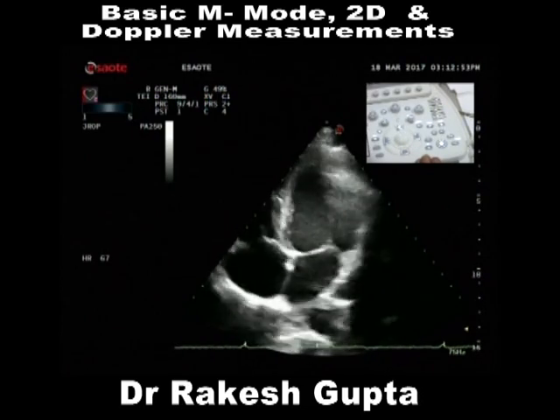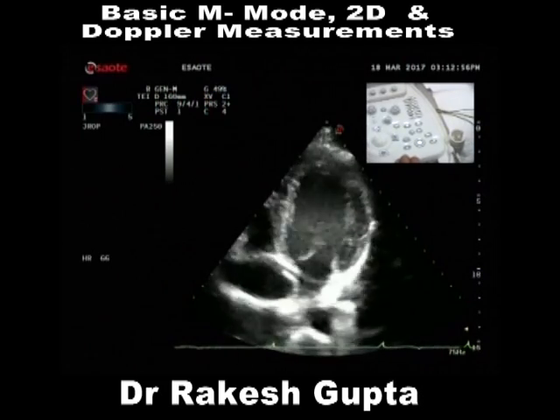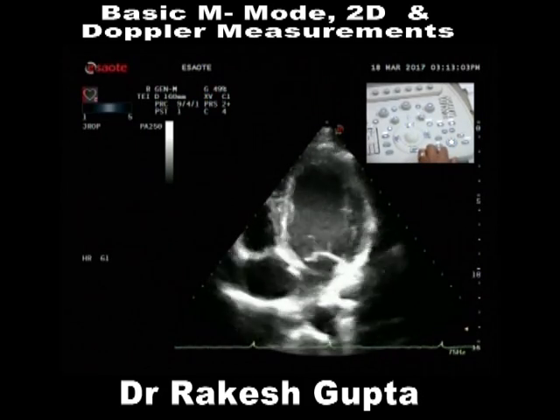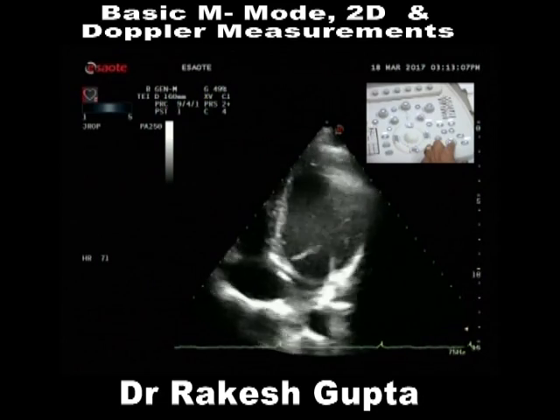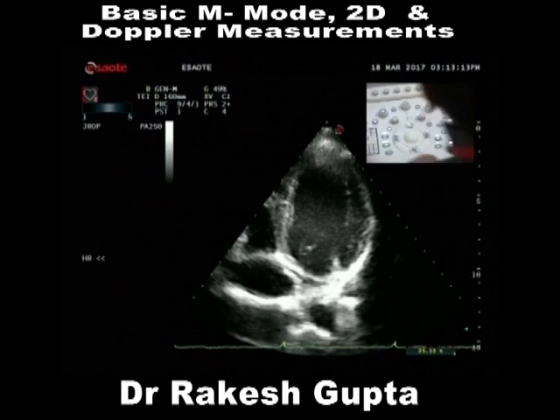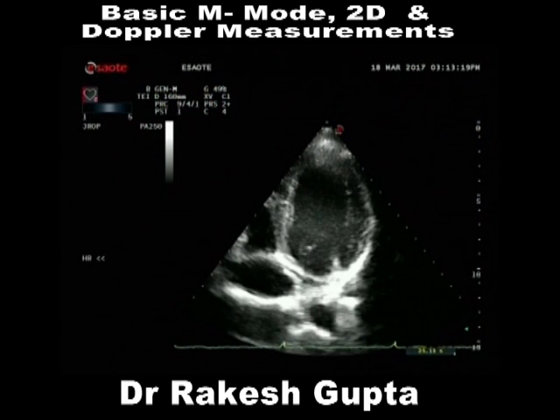Can anybody say? With inspiration his imaging is overlaid by lungs. So I am going to ask him to breathe out and hold, hold his breath after expiration. Breathe out, and stop. Okay, take a breath. Don't tell him to hold his breath for long.